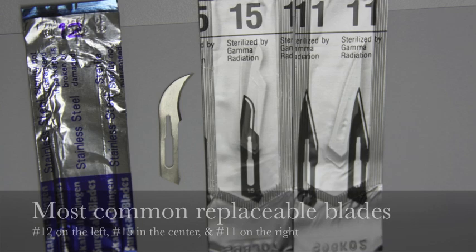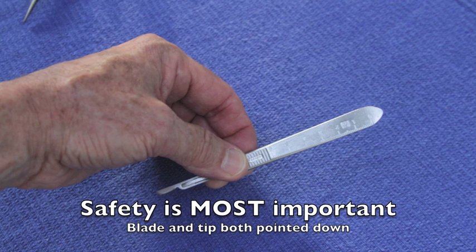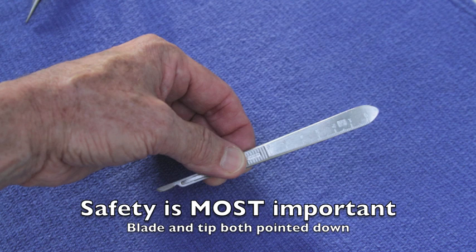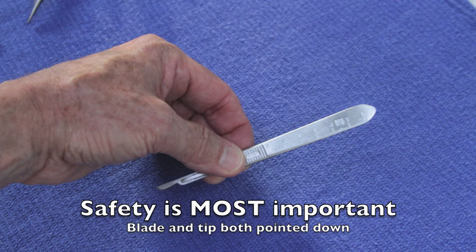In this photograph, you can see how the dental assistant is holding the scalpel. Notice several things. First, the handle is exposed so the surgeon can grab it. Second, the instrument is being handled close to the blade, but not so close as to crowd the blade and jeopardize the safety of the fingers. And third, notice that the point of the blade and the blade itself are pointing downward. In this way, the blade is away from the palm of the hand, and by passing this way, the surgeon can receive the instrument safely, and at the same time, the dental assistant or the surgical assistant is able to pass it also safely. This is crucial for the safety of the staff.